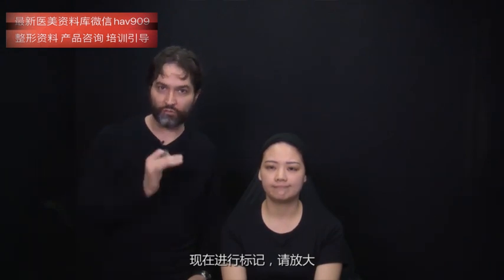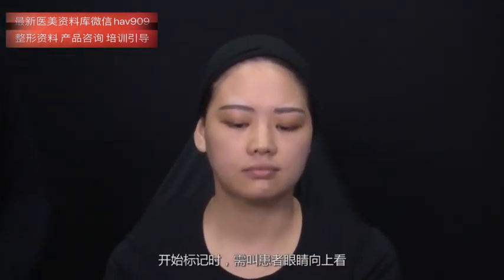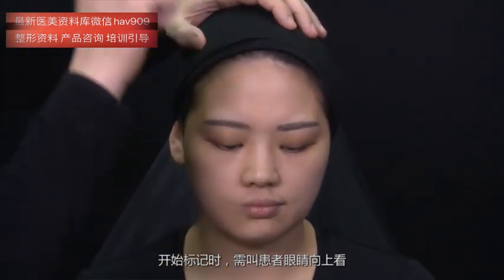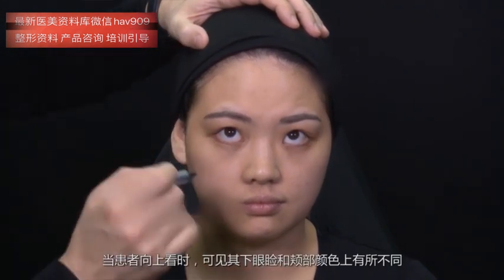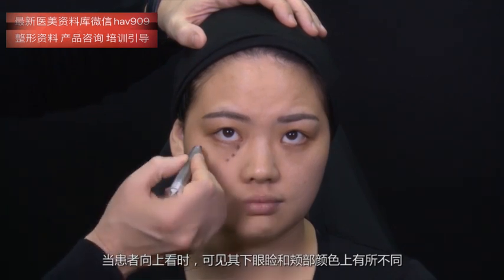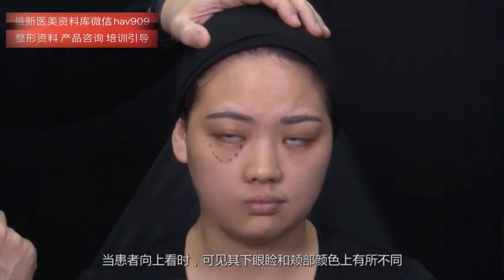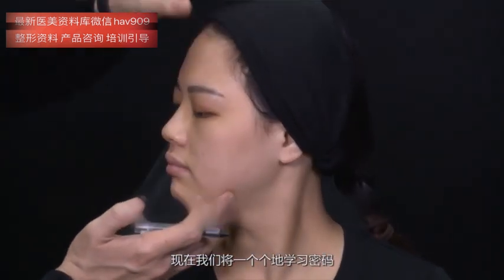Now, let's proceed to marking. Let's zoom in, please. When we go to the marking, we have to ask the patient to look up. When the patient looks up, we notice the difference in color between the lower eyelid and the cheek. So, let's study code by code.